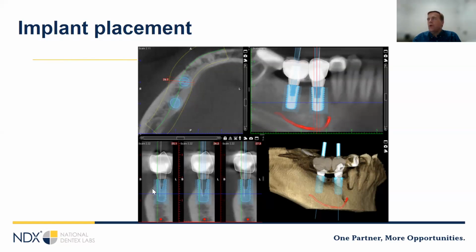Historically, the word has been, don't put two implants next to each other in the aesthetic zone. I've seen a couple studies recently that are saying that there are some implants that have good enough crestal bone retention that you're not getting that flat conic shape in between. But I would say still in general, the safer procedure is to try to figure out a way to not put two implants next to each other.